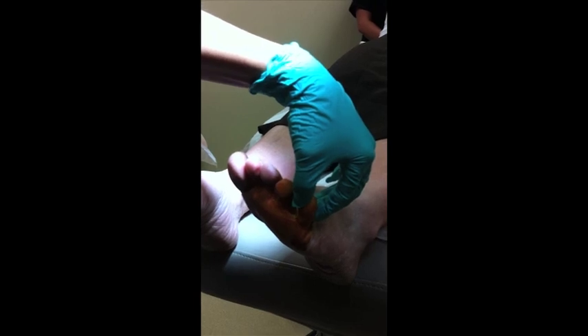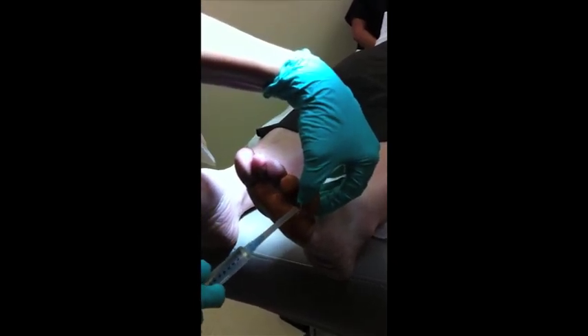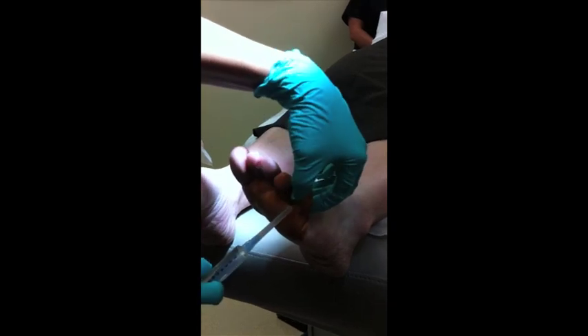This is the hammer toe and I can pull it straight. Any toe that we can pull straight, we know that we can straighten by cutting the tendon that is deforming the toe. In this case, the flexor tendon is our deforming force.